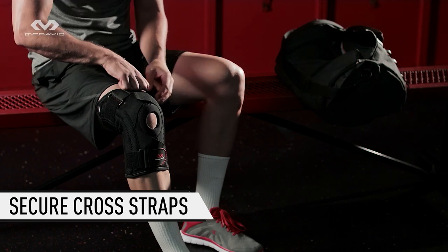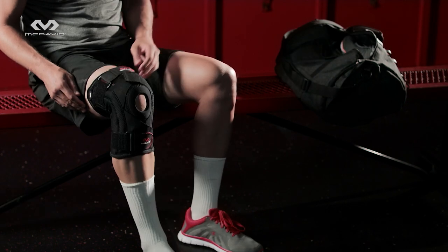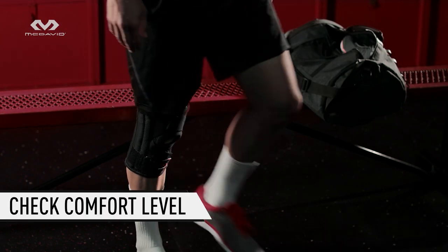Tighten cross straps to a comfortable and supportive tension level. Stand, move around, and adjust straps if needed.